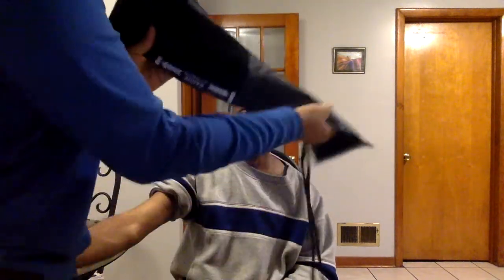And what you want to do is you want to make sure when you wrap this around, it's facing this way. So you'll wrap it around, and you'll put it on the side of their arm, and you'll make sure it's in line with the antecubital fossa. So you make sure the cuff is above, as you can see, above this area right here, where antecubital fossa is at. You will wrap it around, making sure it's tight and secure.